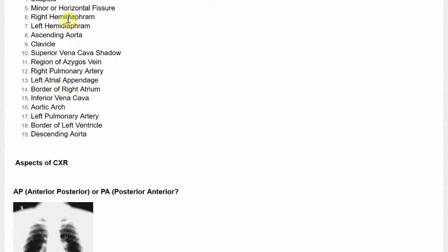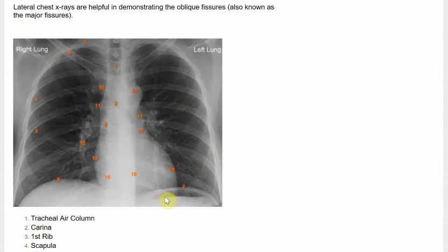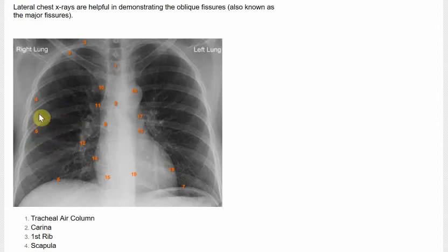A good chest X-ray means you can see the ninth posterior rib. Let's see if this was a good respiratory film — so you've got your posterior ribs: first, second, third, fourth, fifth, sixth, seven, eight, nine. So that's a good film — a good inspiration film. For example, if the hemidiaphragm is set up higher, it's a poor film. The diaphragm should be just above the ninth rib. You can also see the anterior ribs here, so you can distinguish posterior ribs from anterior ribs.